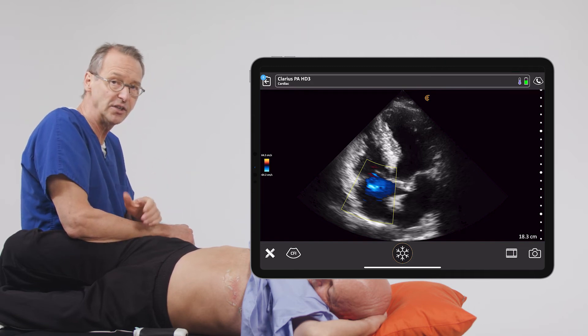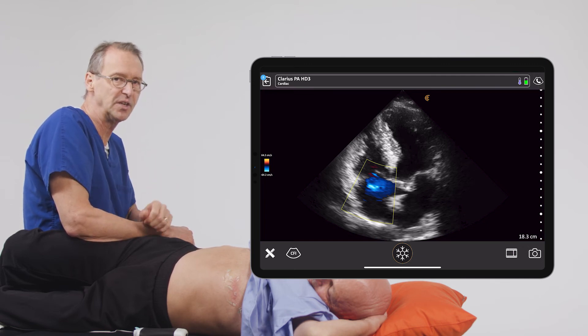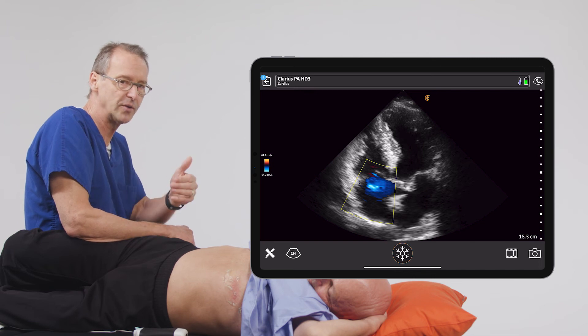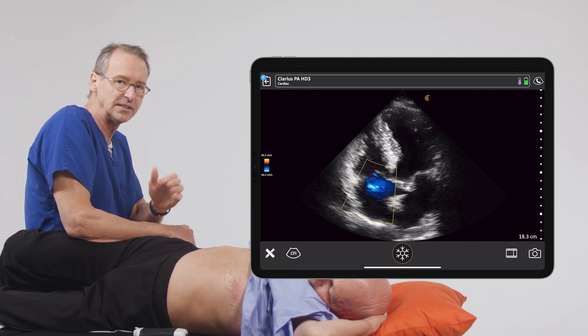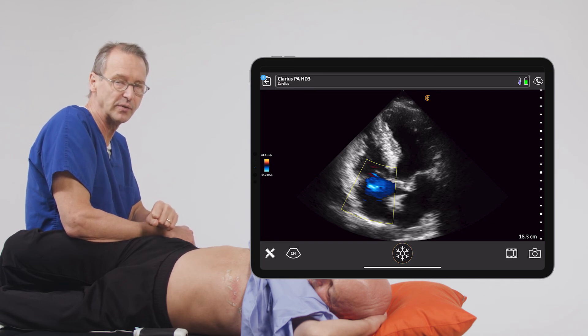So in summary, this is how you can use color doppler to assess your patients for tricuspid regurgitation. And when we find this in the emergency department or with other physicians practicing at the bedside, this is an indication that we should refer these patients to cardiologists for further evaluation.